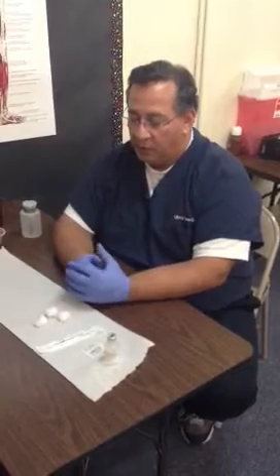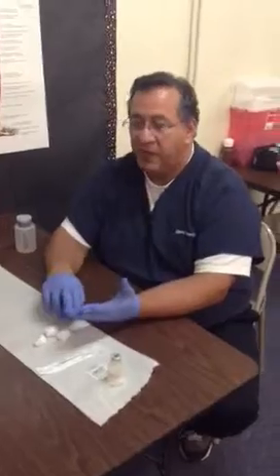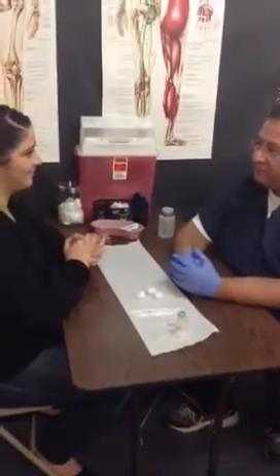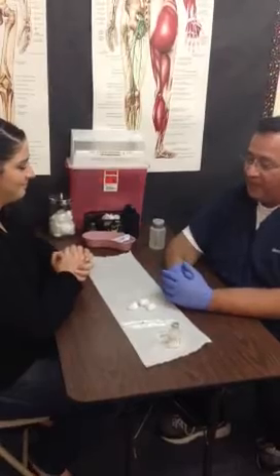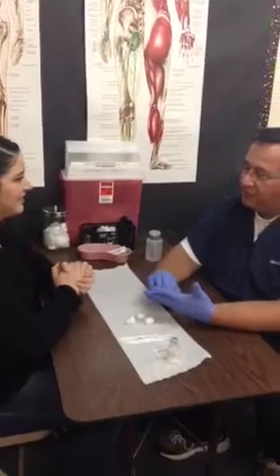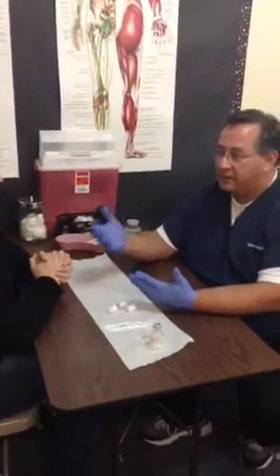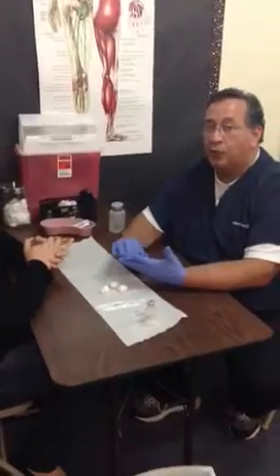The next thing you're going to want to do is begin the procedure by asking your patient to state their name and to find out if they have any allergies, just like we did for the intradermal. So hi, my name is Carlos, I'm your medical assistant and I'm going to be performing an injection on you today. Can you state your first and last name for me please? My name is Jane Doe. Can you state your date of birth? 8-12-93. It's important that you know you have the right patient and that the information they give you matches the orders you have from your doctor.